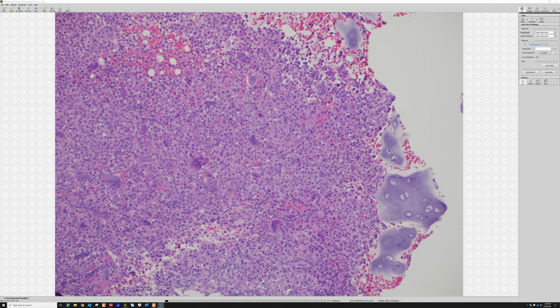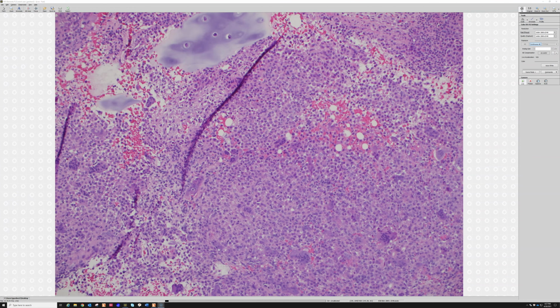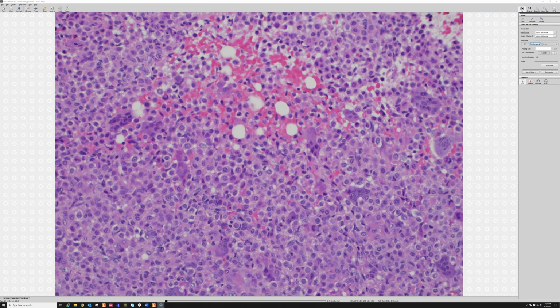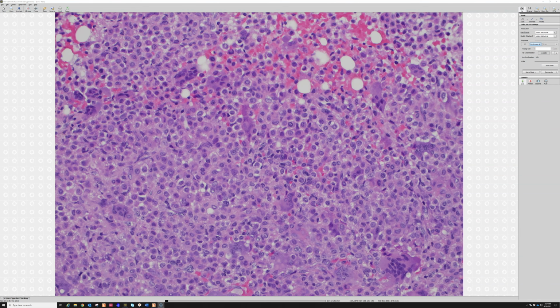A very distinct appearing tumor. It's extremely rare, but it's an important tumor to know about because it can mimic some other things. It doesn't look like a typical chondrosarcoma, and it also has different prognostic implications. It tends to, in general, have better prognosis than some of the other forms of high-grade chondrosarcoma.